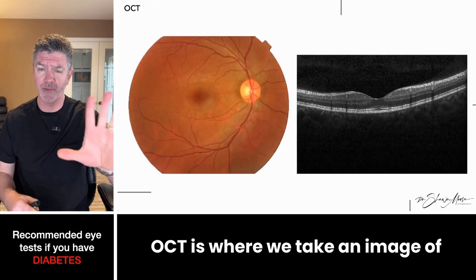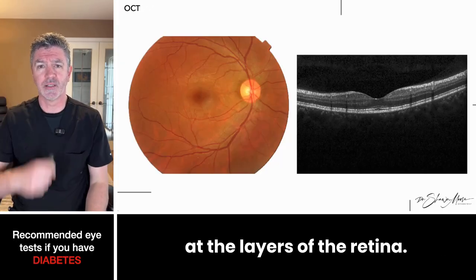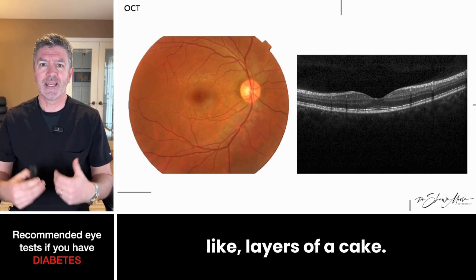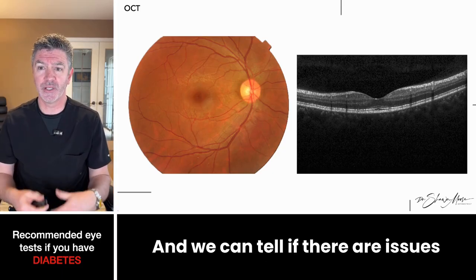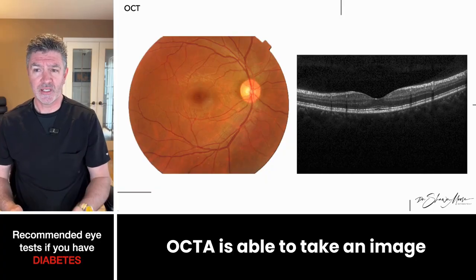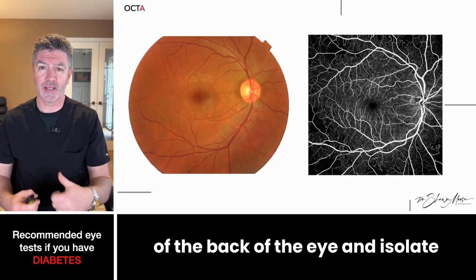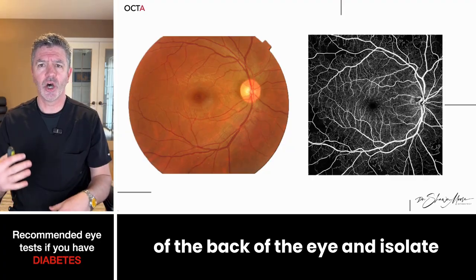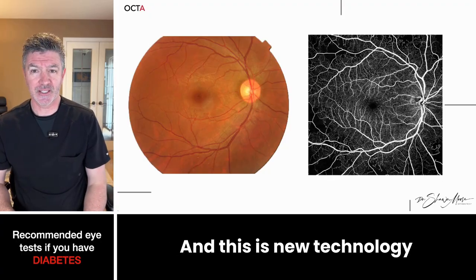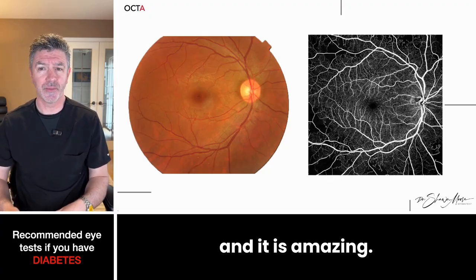And then the next one is OCT and OCTA. OCT is where we take an image of the back of the eye, spin it, and look at the layers of the retina. So now we're looking at the cellular layers of the retina like layers of a cake, and we can tell if there are issues in the back of the eye. OCTA is able to take an image of the back of the eye and isolate all of the individual blood vessels in the back of the eye. And it looks like this, and this is new technology, and it is amazing.